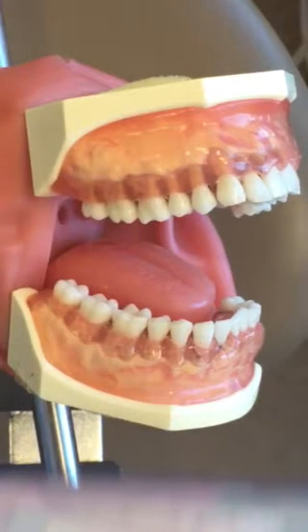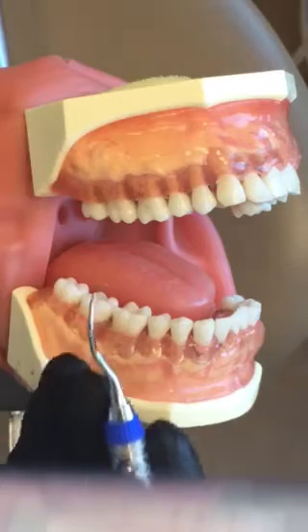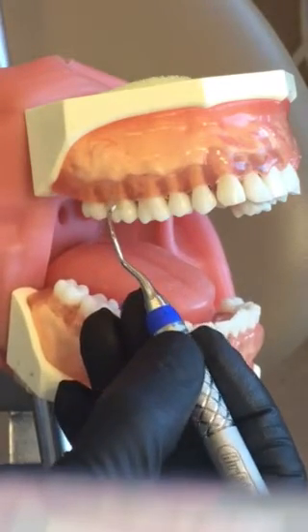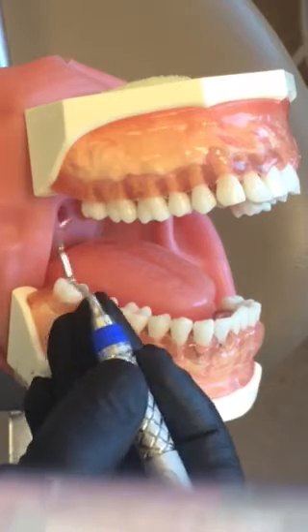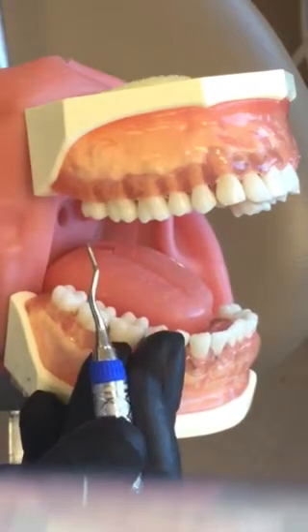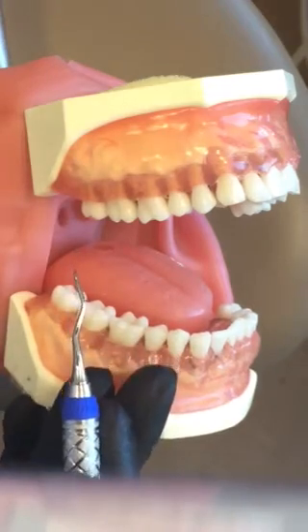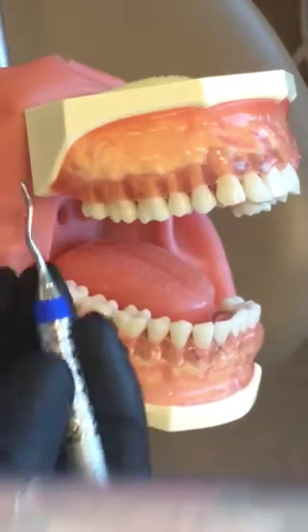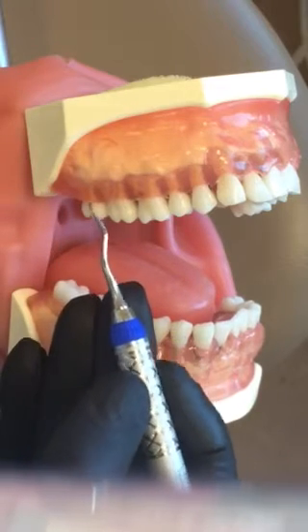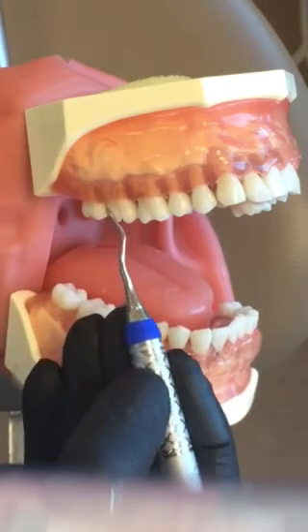The Gracie 11-12 is an area-specific curette used from the distal line angle across the buccal and mesial only. Working here on the upper right, I have my patient in maxillary position. I'm at 8 or 9 o'clock. I'm going to fulcrum extraorally and establish my correct working end, looking for parallelism.